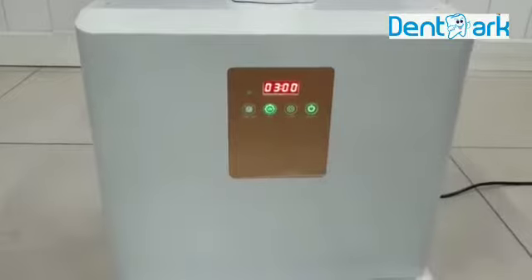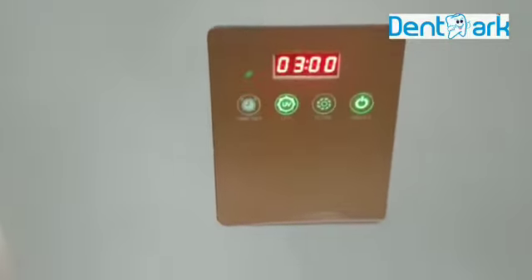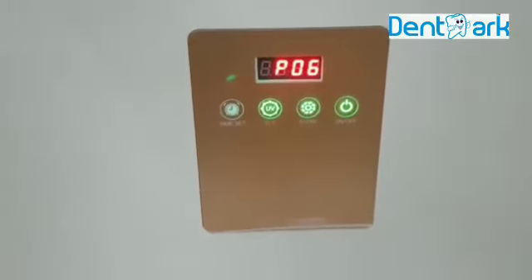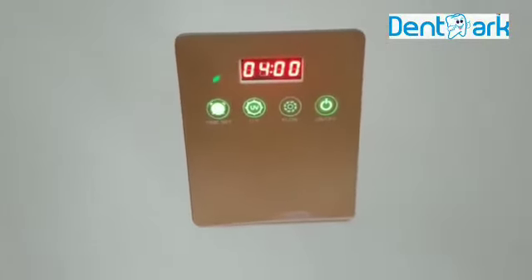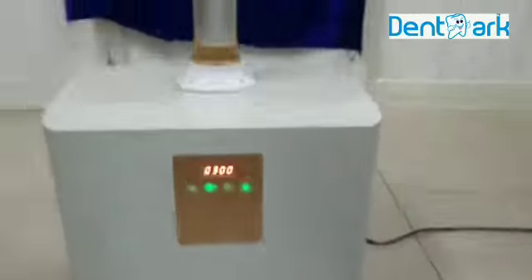If you want to switch off the UV light, you can switch off the UV light. If you want to switch it on, you can. This is the speed level, and this is the time. I will show you the speed level — how powerful it is.